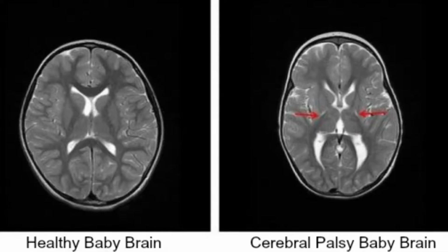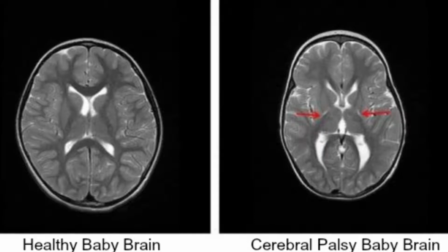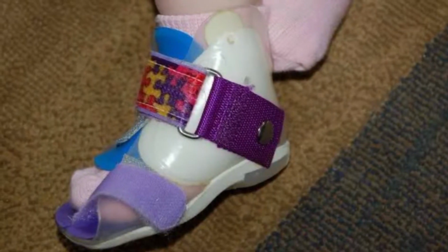One of the most common conditions that we treat is cerebral palsy. It's trauma, it's damage to the infant brain that will affect the way that they walk. Quite often leg splints are so important because it helps them to function better, it helps them to function with less pain, with less discomfort, and also prevents that deformity as they grow.